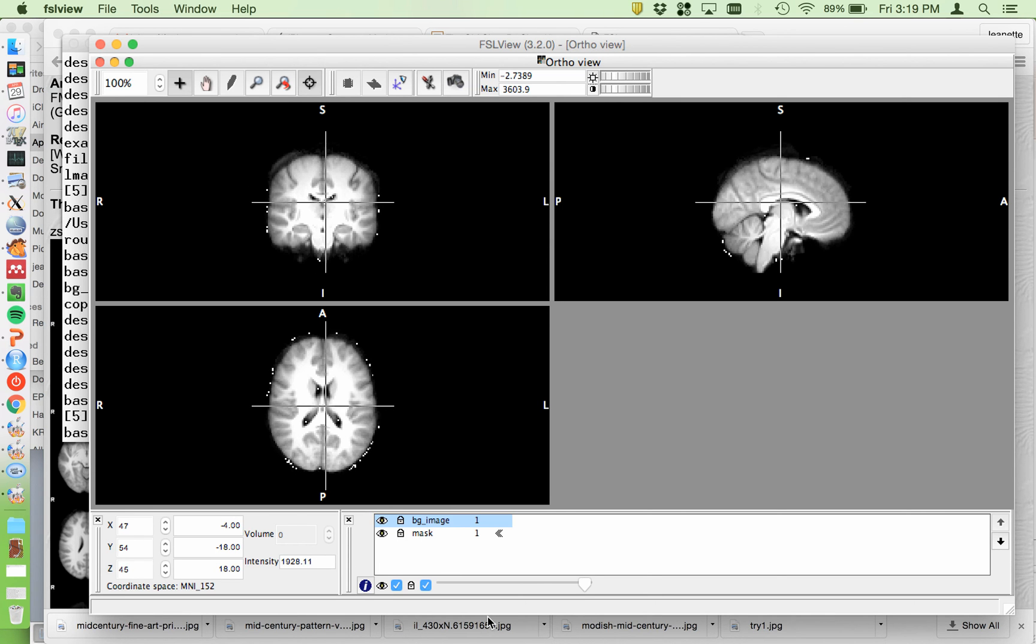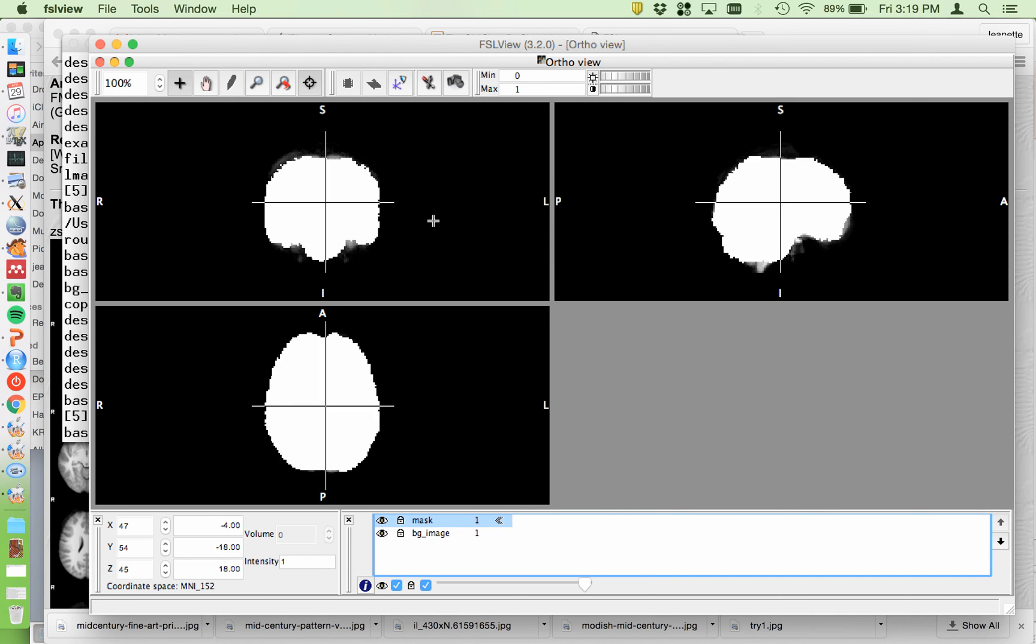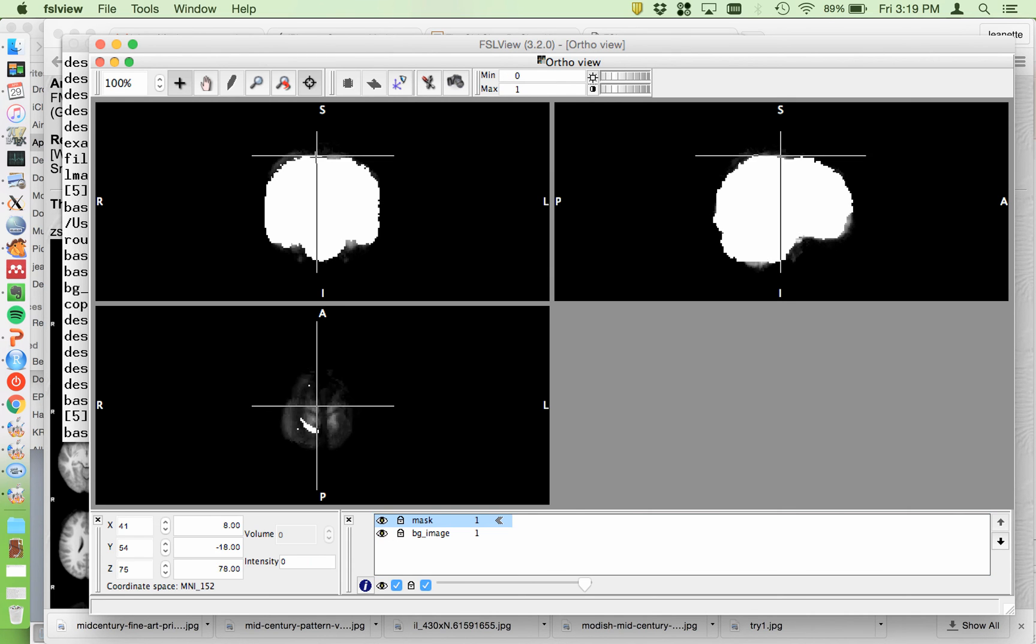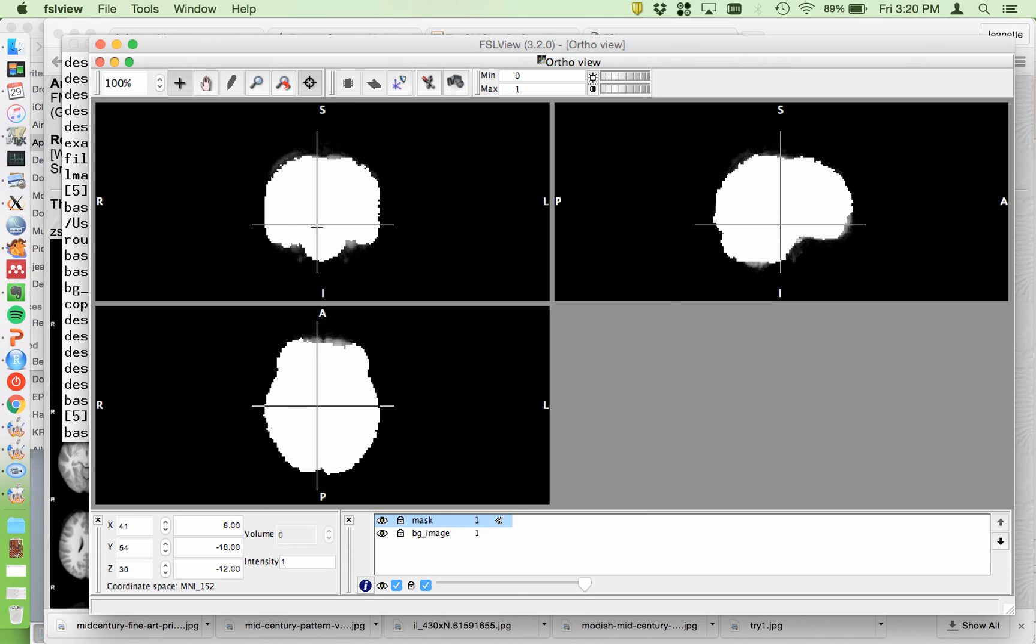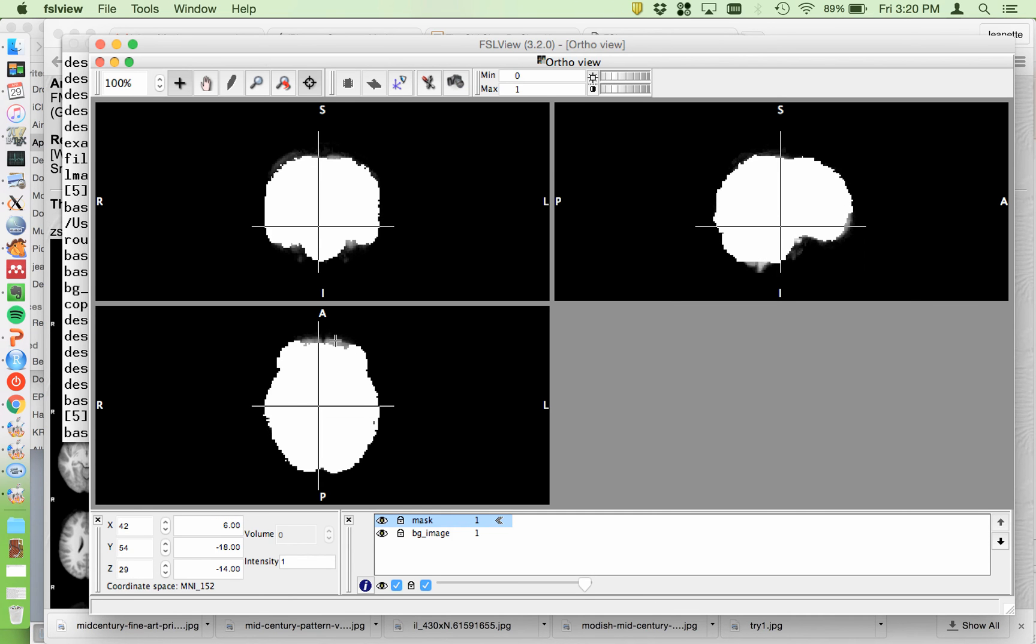So then just put the mask up on top, do a quick look through, make sure nothing huge is missing. So just some usual frontal stuff dropped out. Okay, so that looks good.